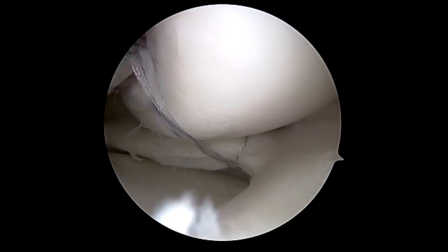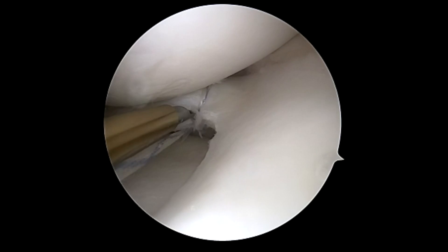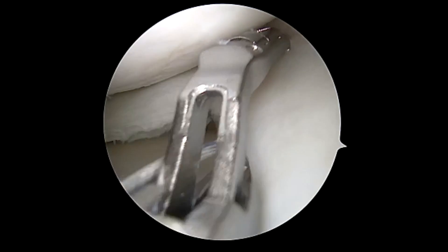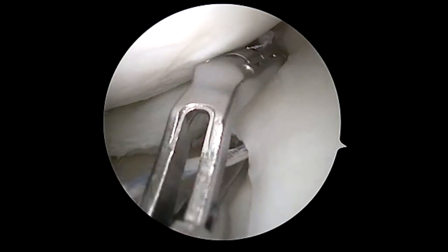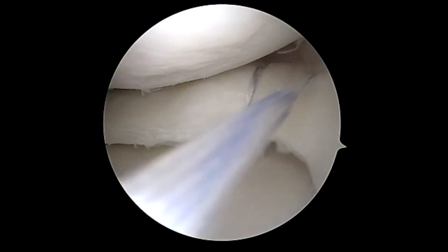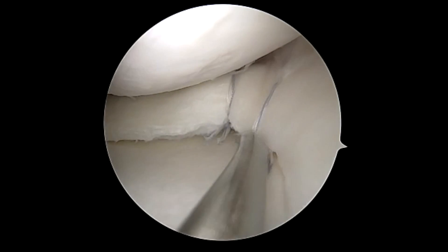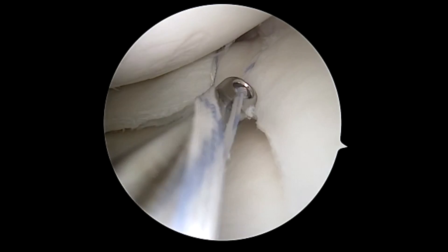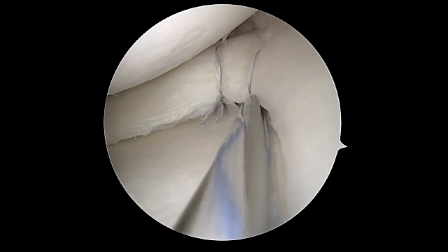Care is taken to make sure you secure the knots well enough to compress the tear together. You can see with the angled portion of the mini pass you're able to get fairly far anterior, and then each time we will sequentially tie this using alternating half hitches. We try to space these ties out between 3 to 5 millimeters to add maximum compression but also allow for adequate healing potential and to not over-constrain the meniscus.